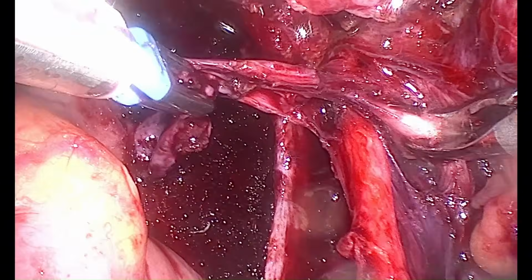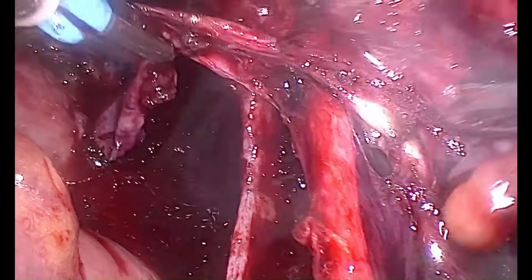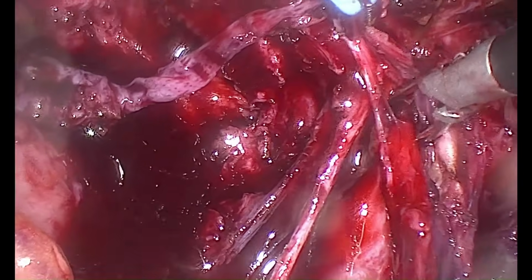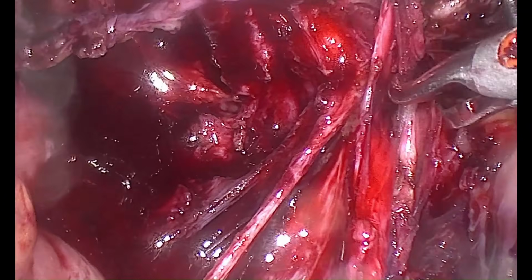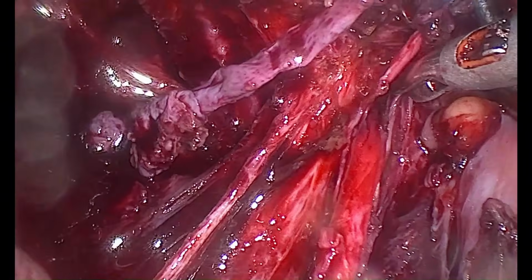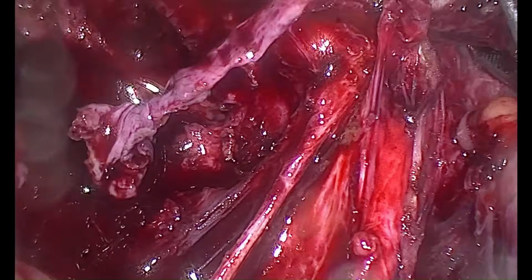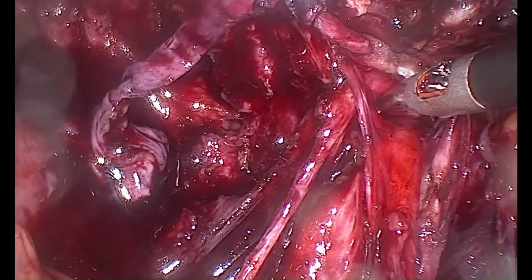This is the uterine artery. So that's why we just coagulated the uterine artery. And I know this is a fertility preservation surgery, but just coagulating this uterine artery doesn't have any impact on the fertility for that matter. This has been documented multiple times, because if I wish to take this endometriotic nodule out, I need to dissect in that particular pathology, and sometimes the uterine artery has to get sacrificed.